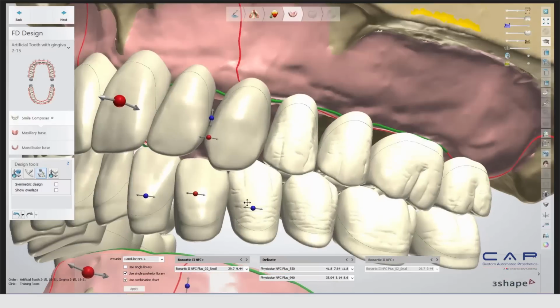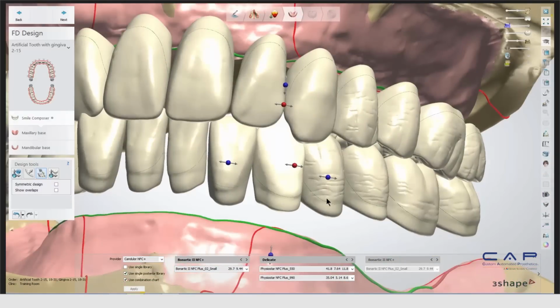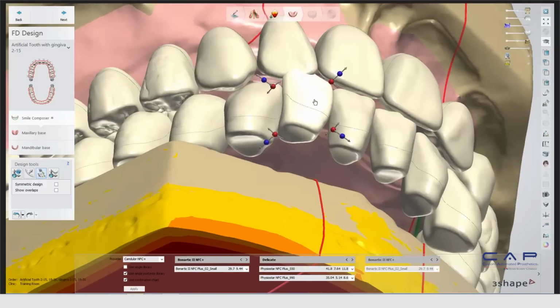Okay. I'm not going to go through the whole process of setting up the teeth. We just want to look at the main workflow. But the setup is there, and the tools that we have are very similar to the full arch cases that you would design normally in 3Shape. So I'm just going to go ahead and rotate these guys out a little bit.